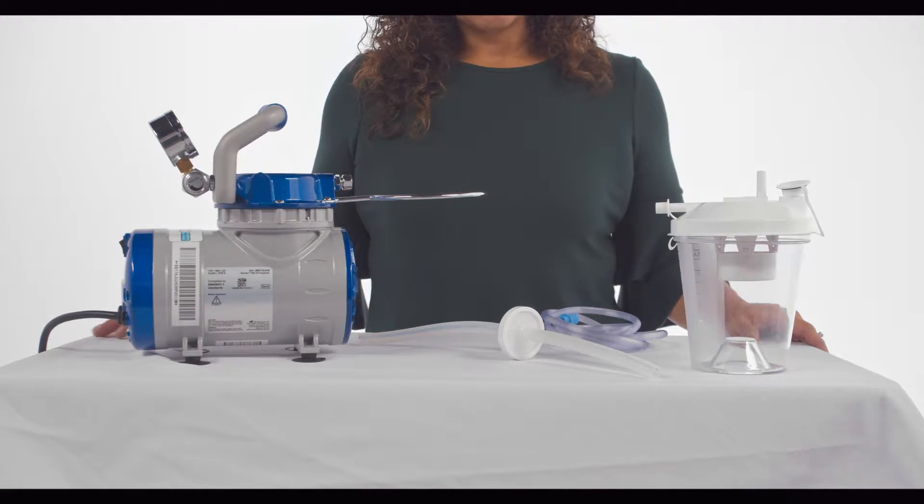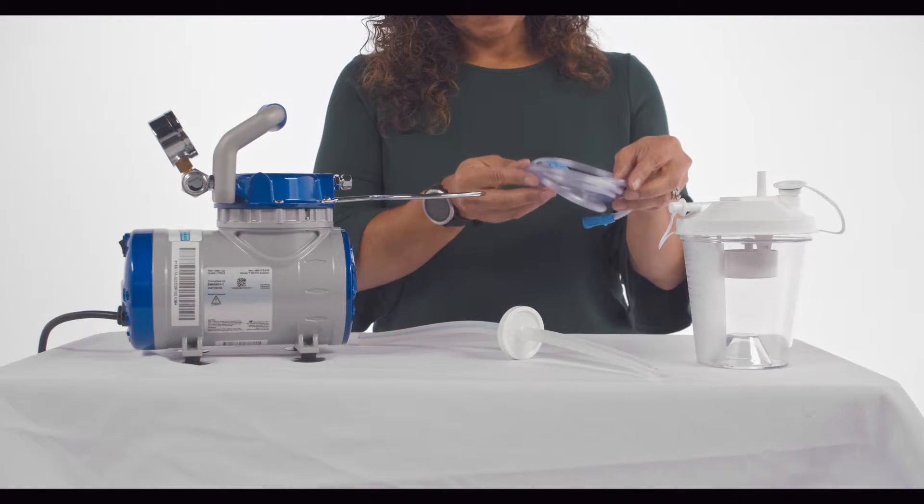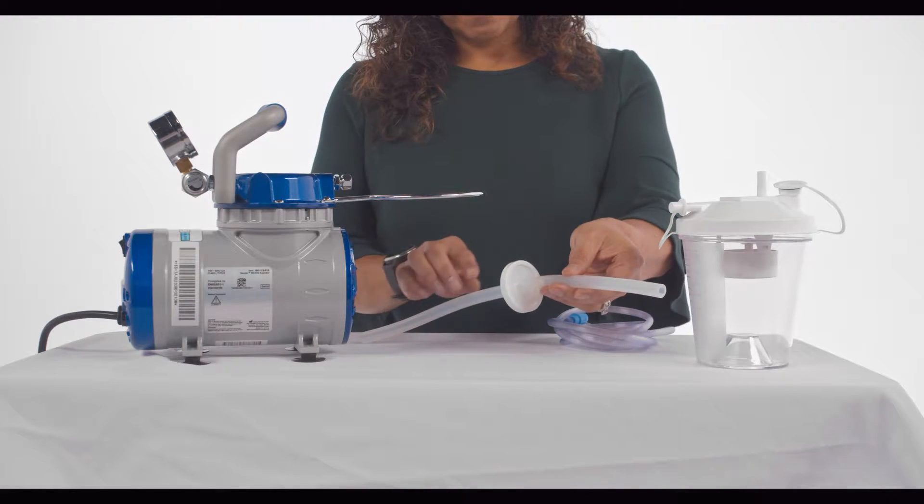With each John Bunn aspirator, you will have the suction machine, collection bottle with top, patient suction tubing, unit tubing, and HEPA filter.